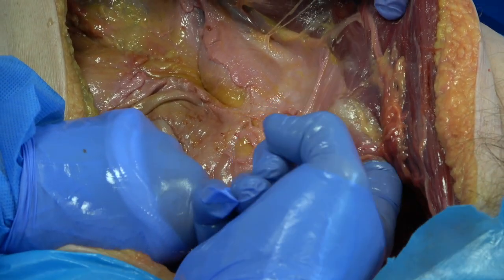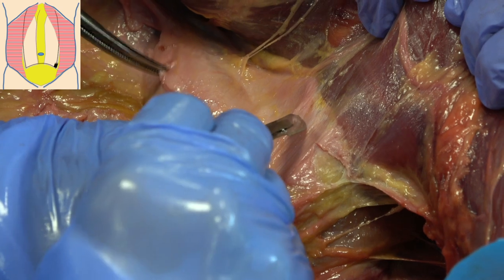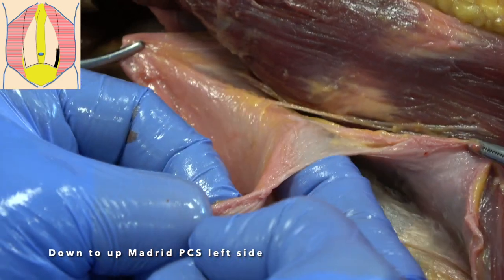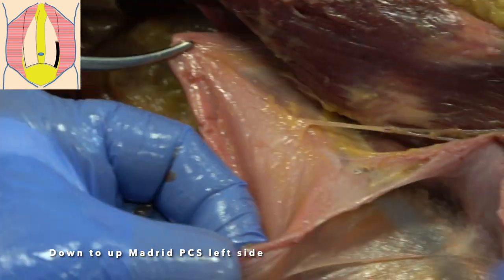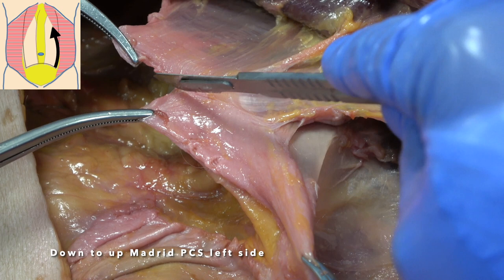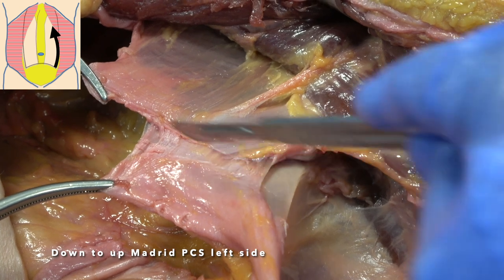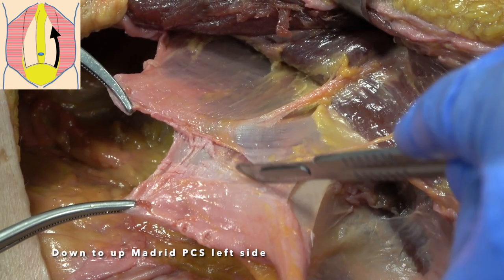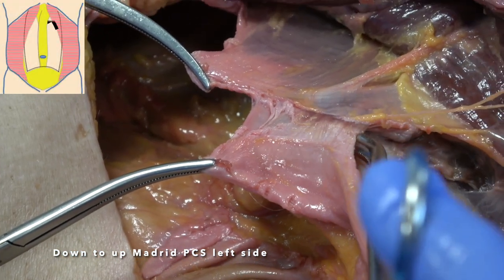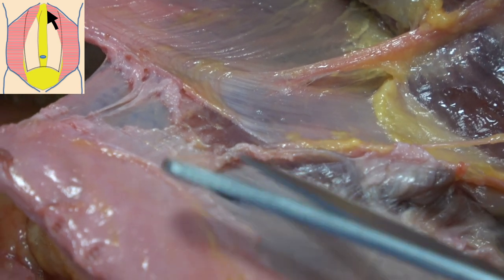Similarly, on the left side we start the posterior component separation from down to up at the arcuate line, again with the aid of the initial finger detachment of the peritoneum from the posterior rectus sheath. There is a constant nerve branch above the umbilical level that can be preserved following the semilunar line. The lateral incision is carried out obliquely to come across the medial incision of the posterior rectus sheath that was stopped about 6 cm below the xiphoid. Here we can observe the layers that form the posterior rectus sheath: the posterior lamella of the internal oblique muscle and the terminal fibers of the transversus abdominis muscle.